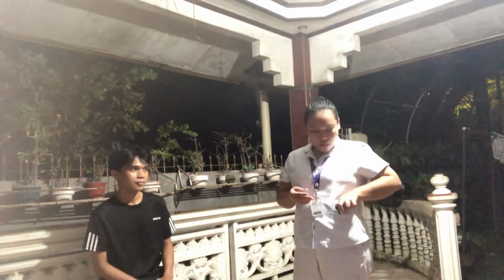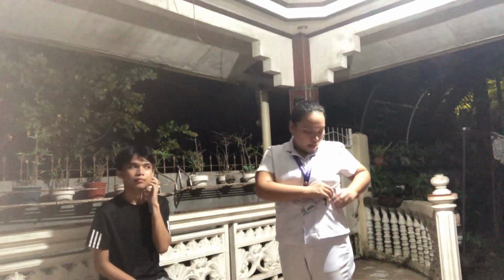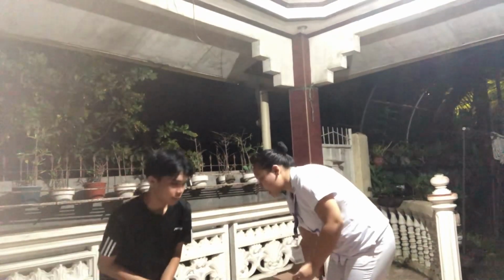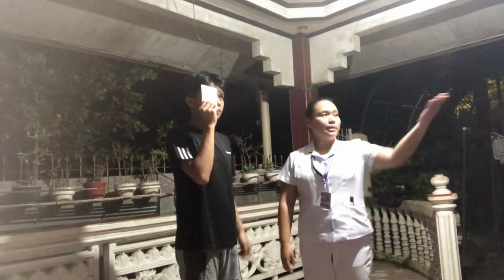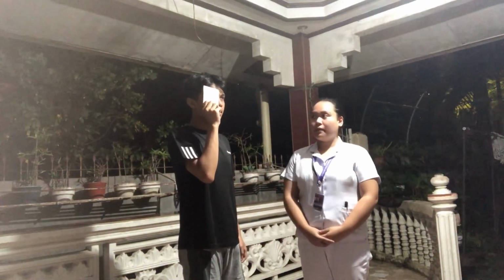Prior to the procedure, I'm going to use a cardboard to cover each individual eye to see the Snellen chart. Sir, please stand here. Please cover your right eye first, and then please read the Snellen chart.